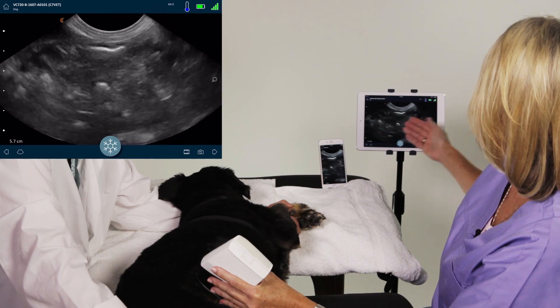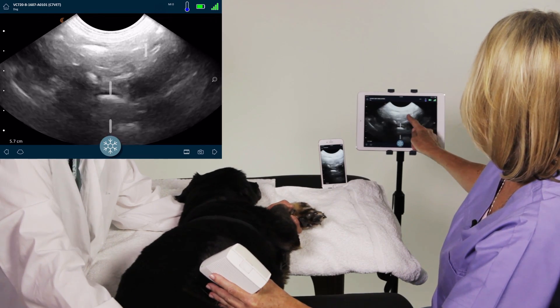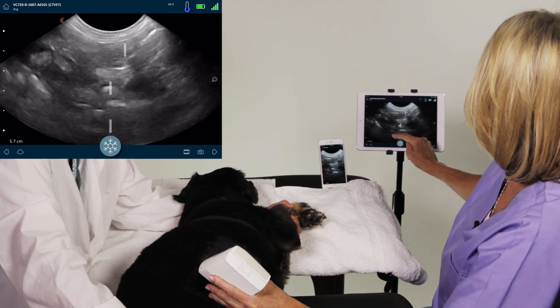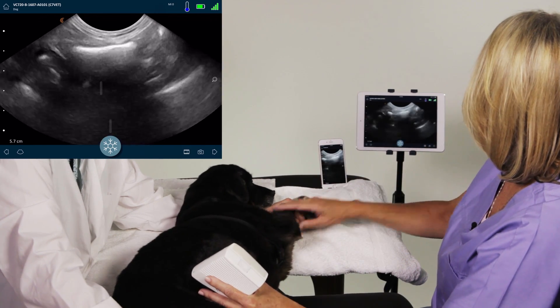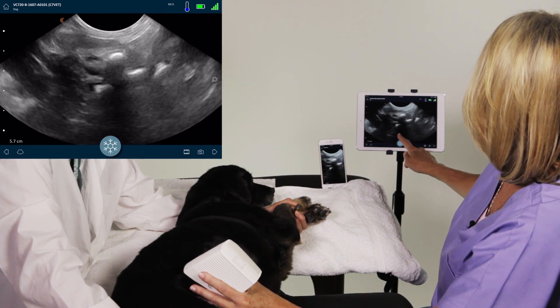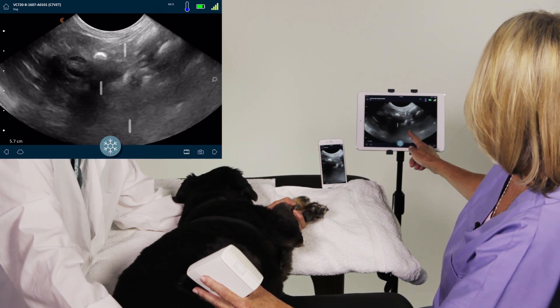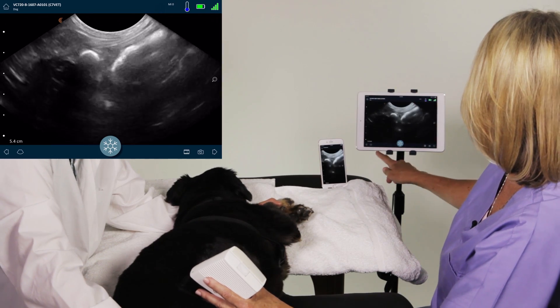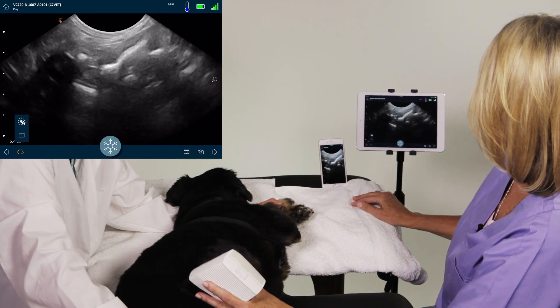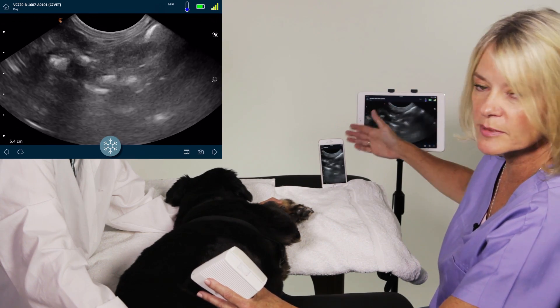I can adjust individual depth gain or time gain compensation by dragging in different areas of the image, which becomes very necessary, especially in different pathology states where you get a shadow or you need to enhance a little bit more in the near or far field. We also have an auto gain where we just ask for it to come up, and it adjusts the gain from top to bottom, side to side — it's all even.